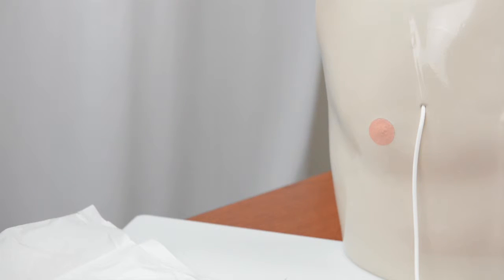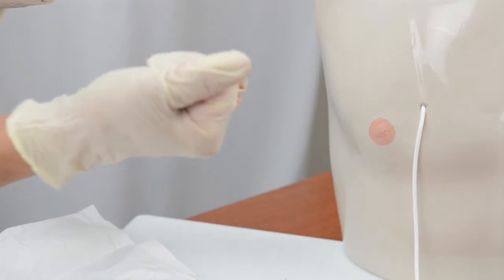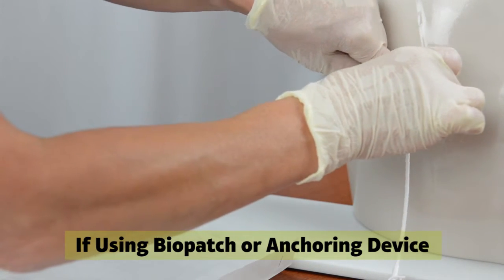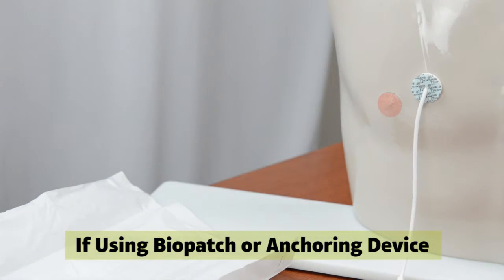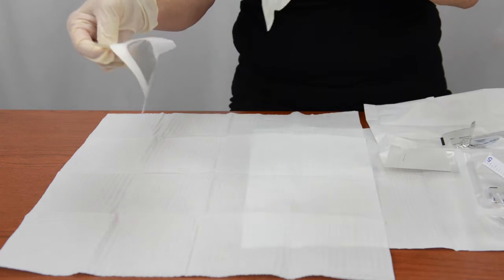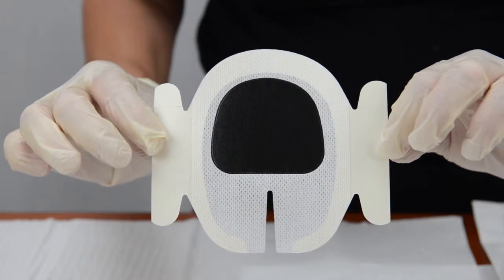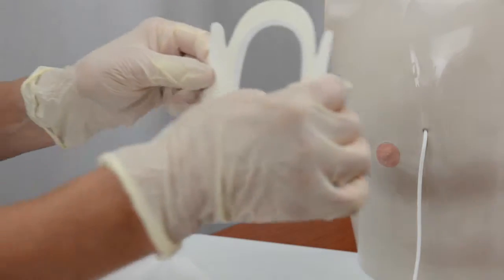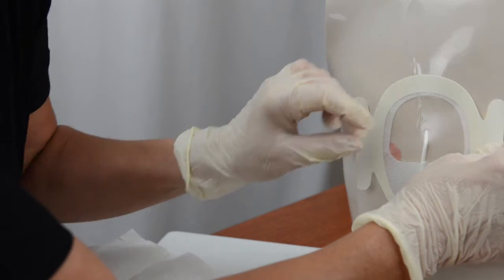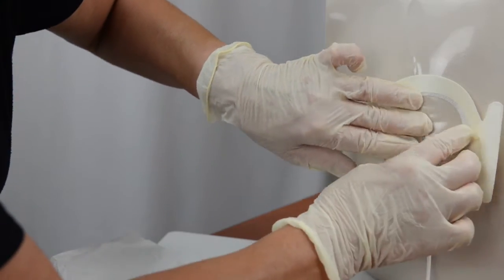You can tell when the skin is completely dry when it no longer looks shiny and when your glove finger remains dry after you touch the site. Apply a biopatch and an anchoring device if you are using them for this catheter, following the manufacturer's or the IV nurse's instructions. Peel the paper backing off the sticky side of the clear bandage and hold the bandage by the paper tabs around the rim. Place the center of the sticky side of the bandage over the catheter entrance site, then press the entire bandage securely against the skin, covering the catheter entrance site and the anchoring device if you have used one.